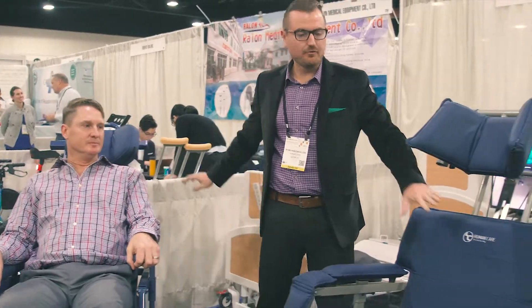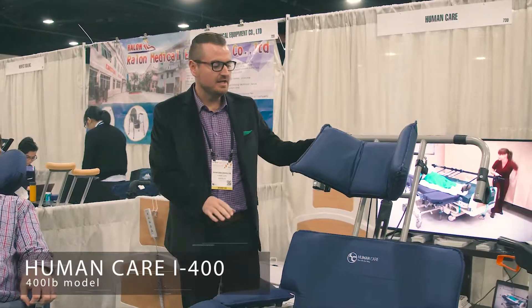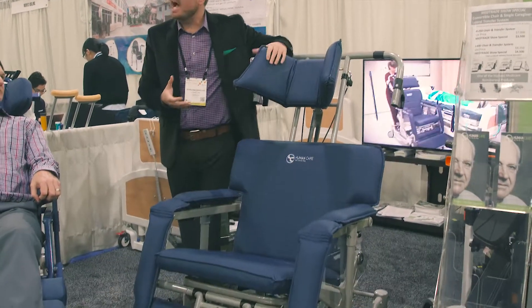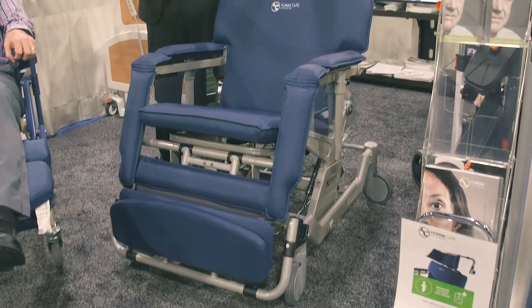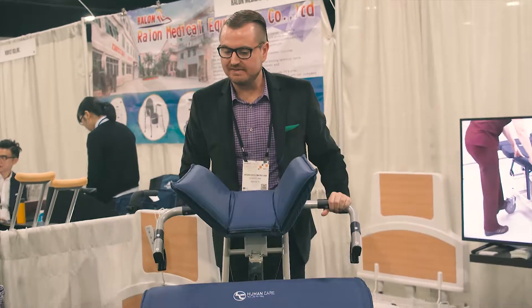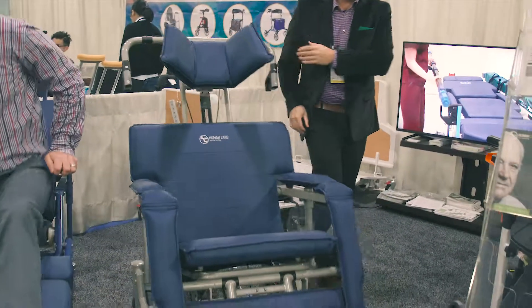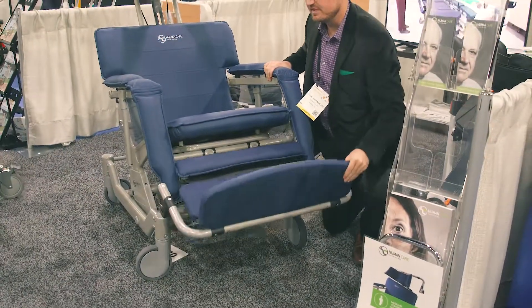Now in the 400-pound chair, most of the functionality is going to be the same — you're just going to have a little more heavy-duty material. The higher viscosity gel is more prominent in this model so that the pressure response is the same. Everything else functions basically the same: tilt-in-space, adjustability with the footrest coming out, foot plate coming up and locking into different positions.